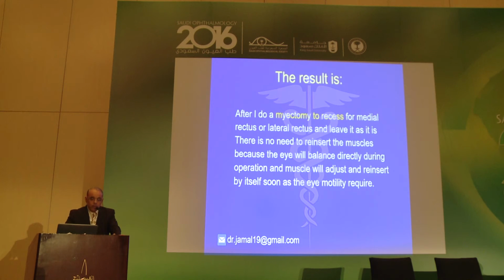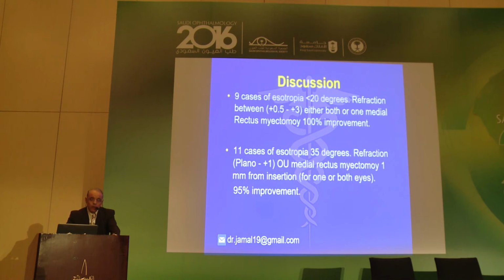And the muscle will also adjust by itself and reinsert as soon as the motility requires. We didn't disturb the eye motility. Leave it as it is. I have many cases.